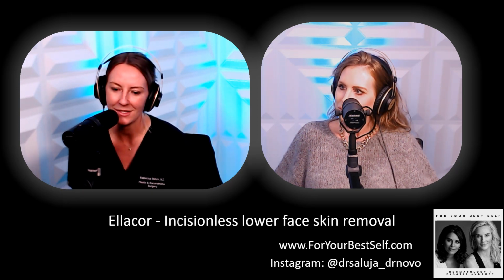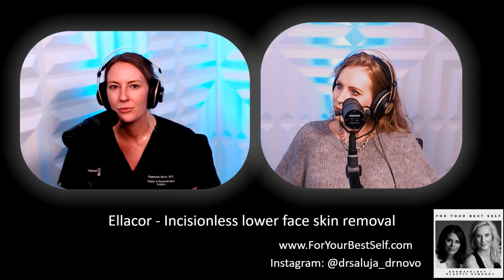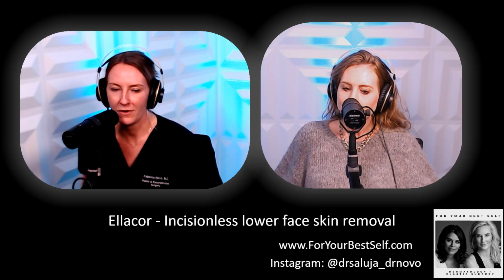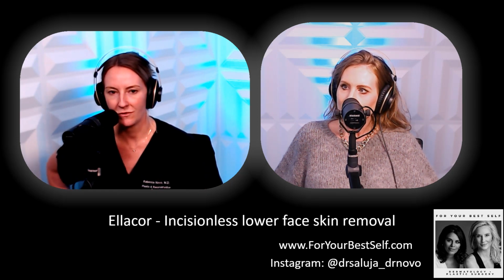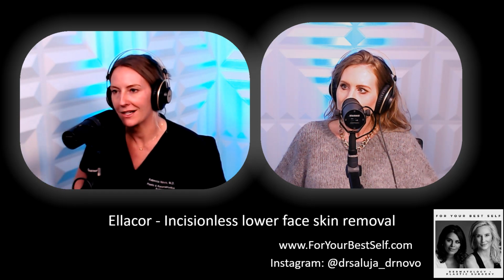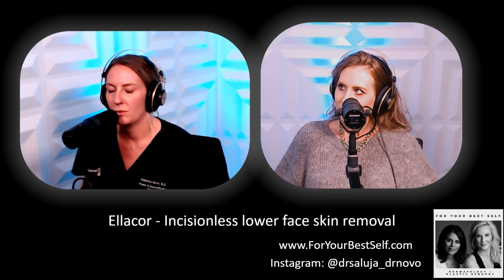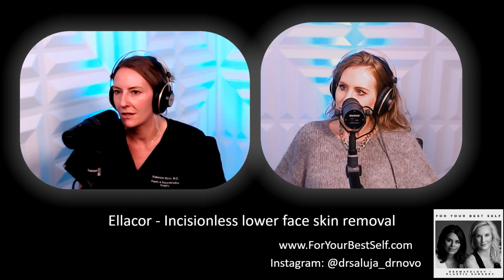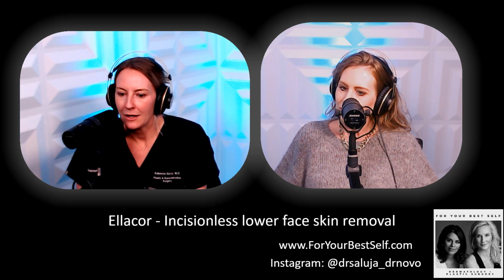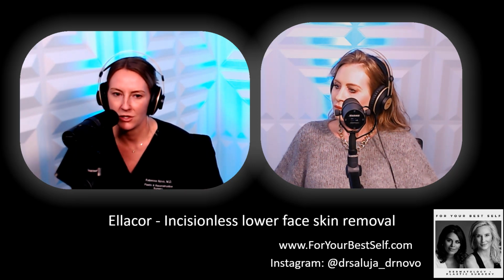So, a little about Ellacor, and then we'll get into the nitty gritty about the procedure itself and Heather's experience and results. Ellacor conceptually is not a brand new idea. It came from the fundamental idea of a core punch biopsy, which, if you think of a cookie cutter, if you've ever had a skin biopsy, it's like a surgical cookie cutter that removes a few millimeters of skin, the full thickness of the epidermis and dermis. But usually they're of a size where we would have to put a suture or bring the skin edges together.